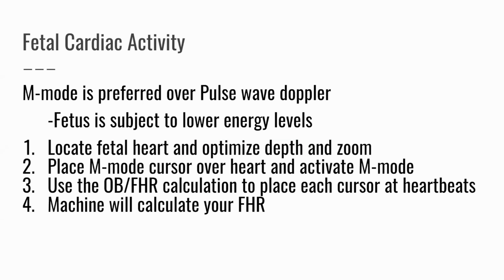So we've covered before, and you may have heard in some introductory ultrasound lectures, about the ALARA principle, that is, as low as reasonably achievable. The idea is that when you use Doppler with ultrasound, you have much higher energy levels than when you use just B mode or M mode. And so fetuses and embryos are particularly susceptible to potential harm from Doppler energy, which is why M mode is preferred over pulse wave Doppler.